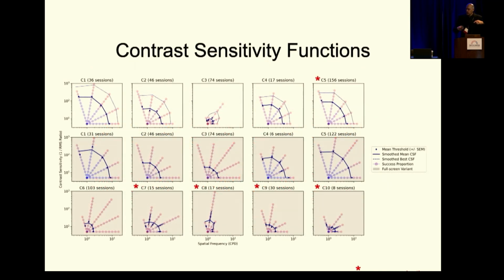This function, I said, acuity and contrast sensitivity. We love contrast sensitivity. I go on and on about contrast sensitivity. It's not measured regularly, it should be, and the reason it isn't is because it's very difficult and time-consuming to measure. So we've come up with a very simple, quick way of doing it, and now we can measure these very complicated things, even in children, as you can see here, that are highly impaired, impaired enough that they are uncommunicative.